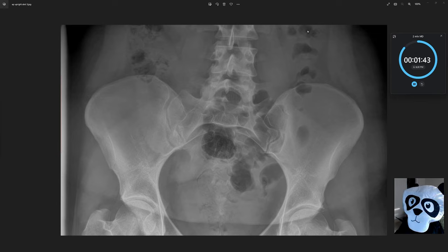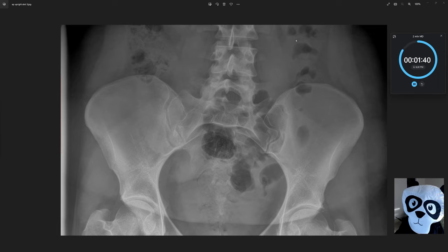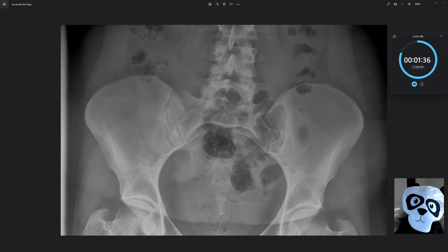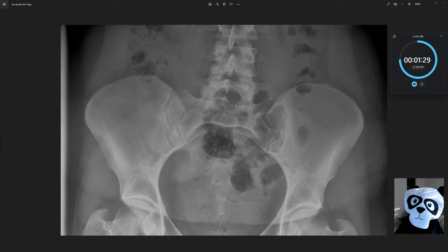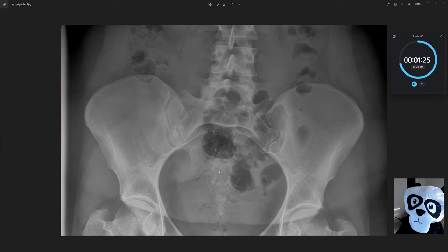If we look at the lateral aspect of the left hemi abdomen, we can see continuation of that descending colon as it enters the left hemi pelvis and becomes the sigmoid colon. Continuing to follow the bowel gas, the sigmoid colon eventually communicates with the rectum.